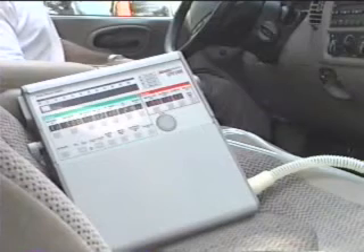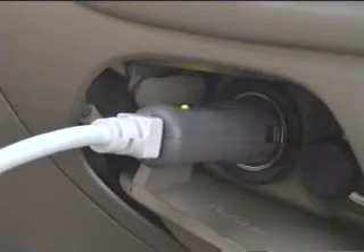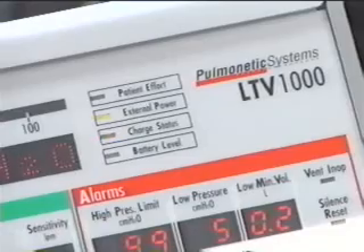To run the ventilator from an auto cigarette lighter, with the ventilator not connected to the outlet, start the automobile. Connect the auto lighter adapter to the cigarette lighter or power outlet on the vehicle. Verify the LED on the adapter shows green. Connect the power connector of the adapter to the power port on the left side of the ventilator. Verify the external power LED shows green or yellow and the charge status LED is lit.